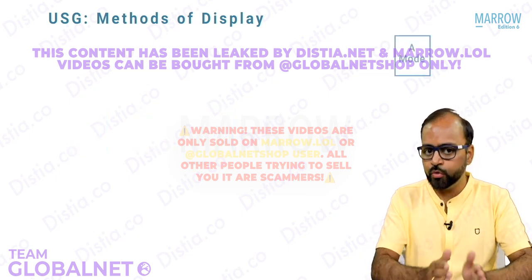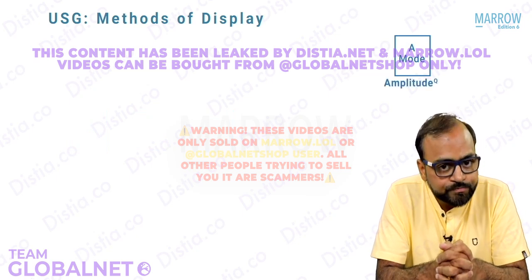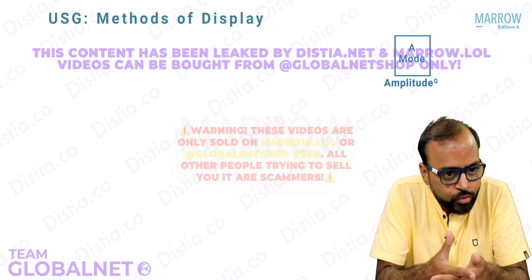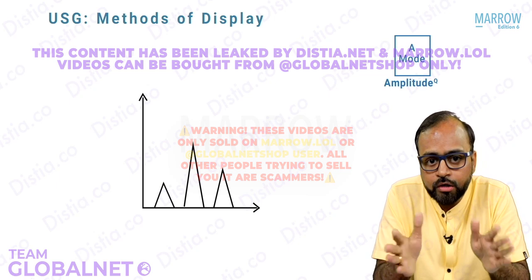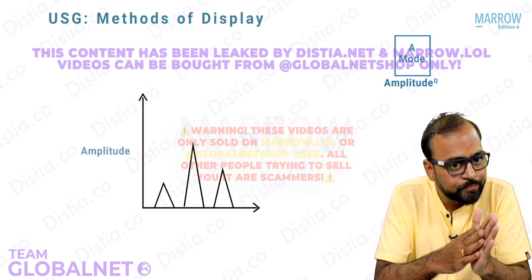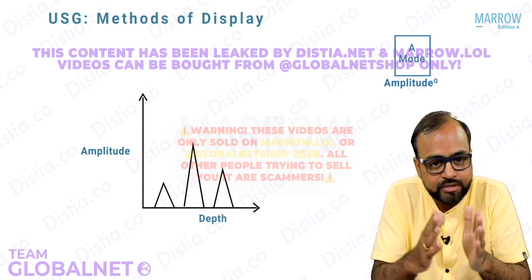So remember, the A in A mode stands for amplitude. What is this A mode? This A mode is a very primitive or crude method. Rather, it is a simple graph or a plot. What is this graph? Look at this graph. On the y-axis, you have amplitude. On the x-axis is the depth of origin of that particular signal.